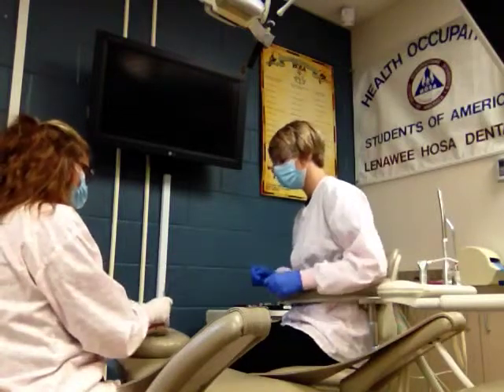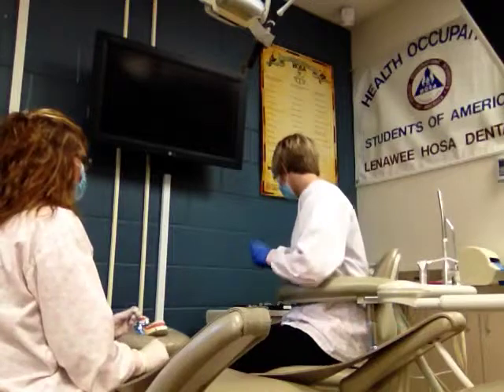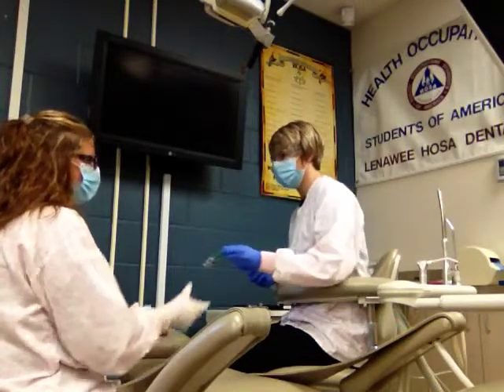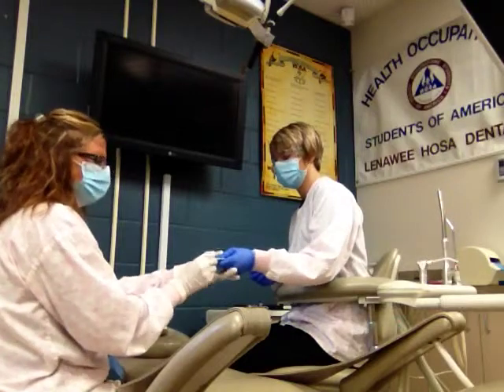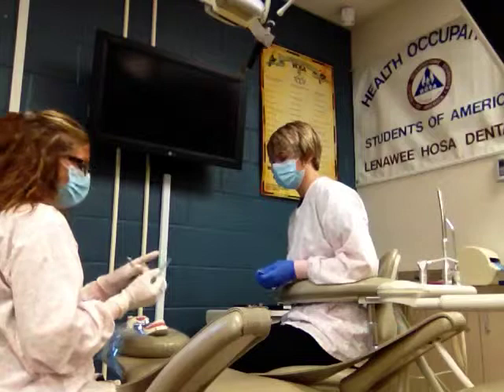If they've had IV sedation, they probably won't be able to tell you for sure if they're numb, but if you see them jump, we'll know that they feel that. And we're going to go to the scalpel. And you are going to leave this in the paper until I grab it. Again, that surgical blade is very sharp.